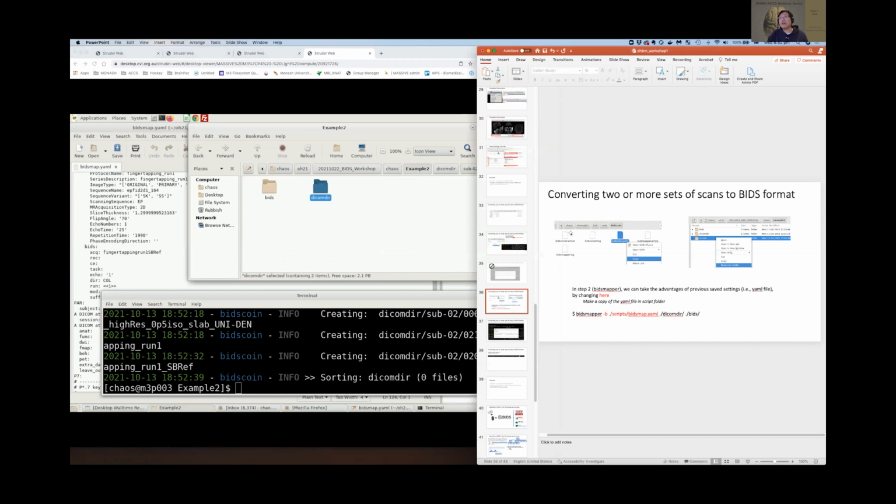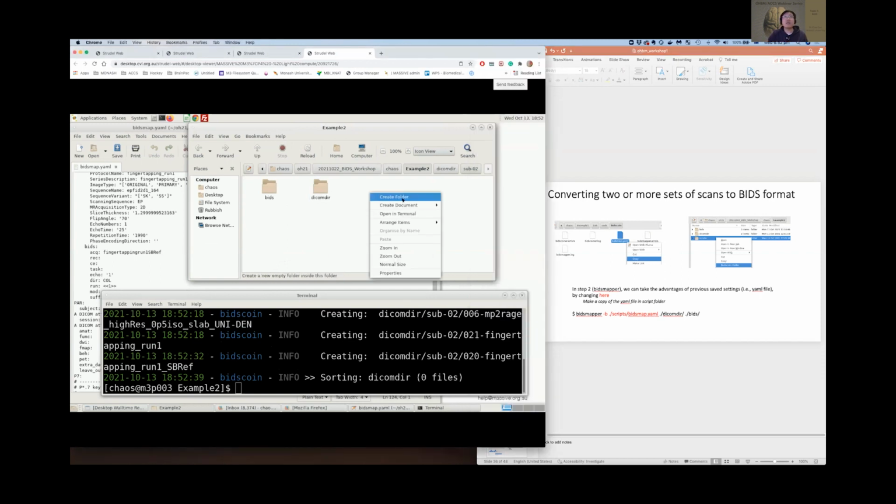We're going to take advantage of the YAML file here, which is the one we saved before. That's a configuration of all of the settings. So I always do this practice. I create a new folder. Remember that I have a folder called scripts. I like to put some of the things I was referring to into that folder and make a copy, but you can also point it to this folder directly. So this is the old YAML file I have, and a copy. I quickly switch to the scripts and just dump it here. Okay, now I'm back to my BIDS, and let's get ready.